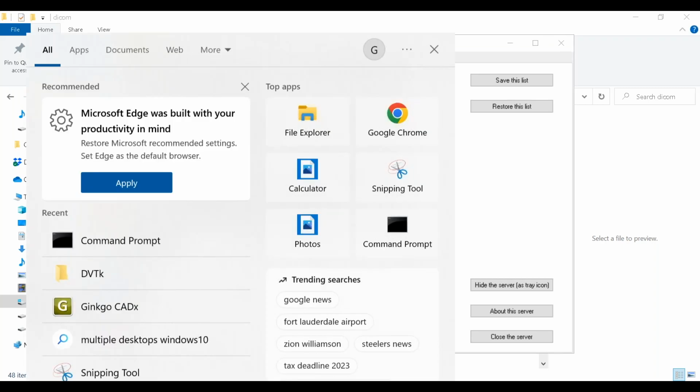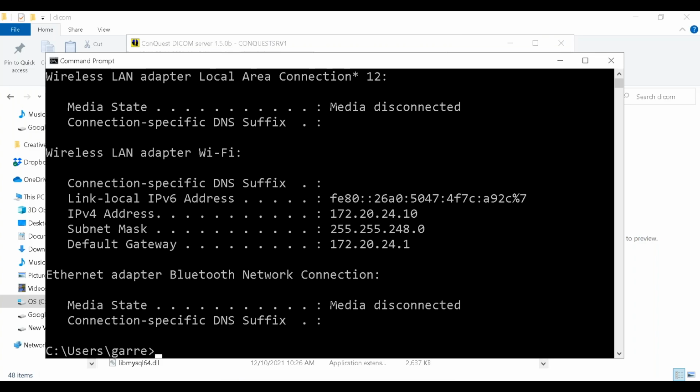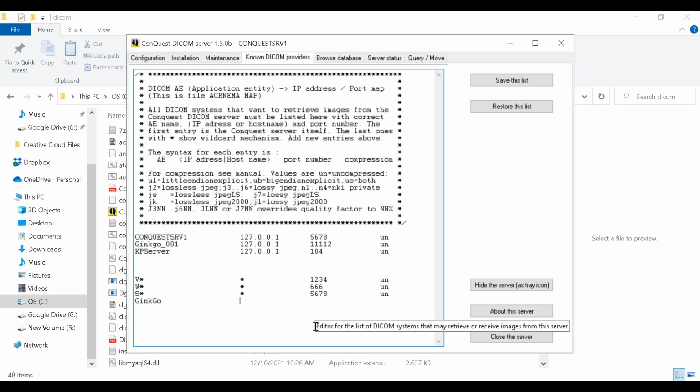Use command prompt. Let's do that. IP config. There you go. So this is my wireless adapter. There is my IP right there. I can copy that. Let's see if I got that. If I don't, I will remember it because I've done this. There we go. Did I take an extra space in there?